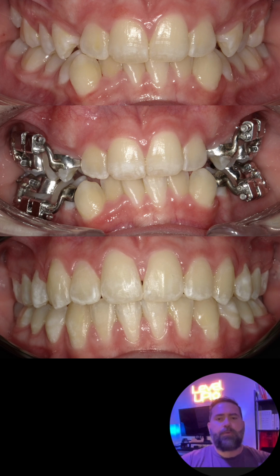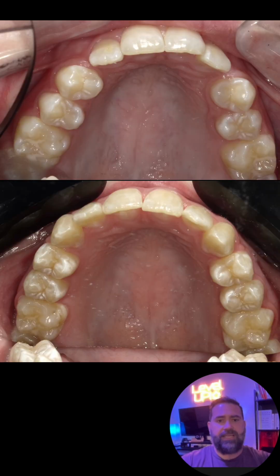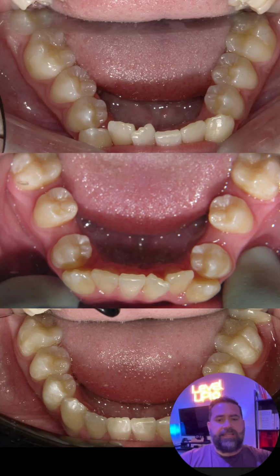So we put on the device in June of 18, and we debracketed after straight wire, after distalization and all that stuff, February 2nd of 21. And that was even prolonged a little bit because of shutdowns from COVID. But there we go. Again, there it is after distalization, and here it is after moving those teeth and making space for those canines. And then here's the lower, looking good. Just after distalization, then we just do segmental retractions and develop the space.